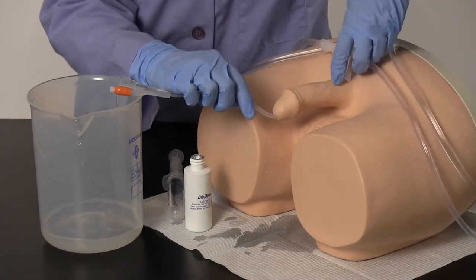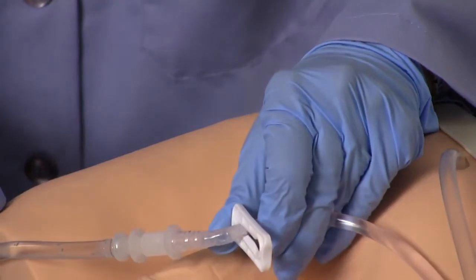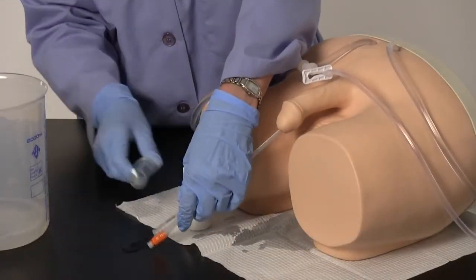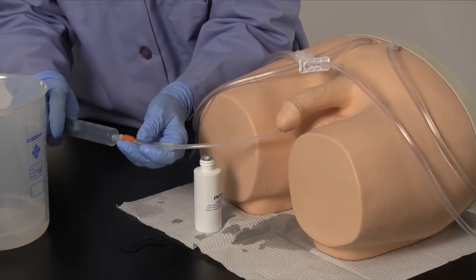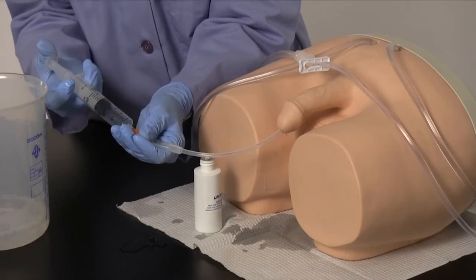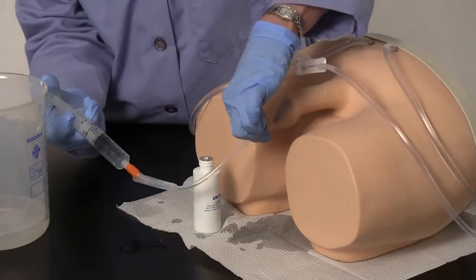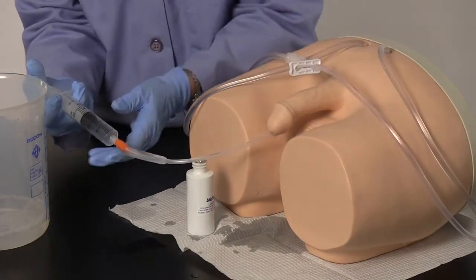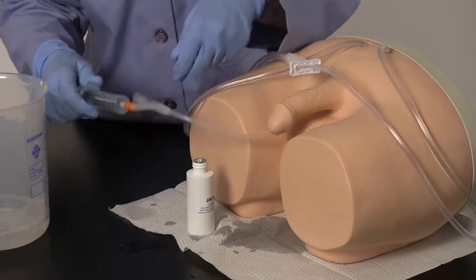To restrict the flow of water when inflating the cuff, slide the clamp closed on the fluid administration set. Connect the 20 cc syringe to the threaded end of the catheter, ensuring the syringe is pulled back and filled with air. Depress approximately 10 cc of air into the catheter to fill the cuff. Gently tug on the catheter to determine proper inflation. Pull back on the syringe, completely deflating the cuff before removing the catheter.